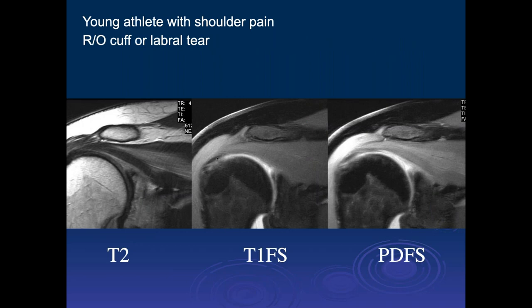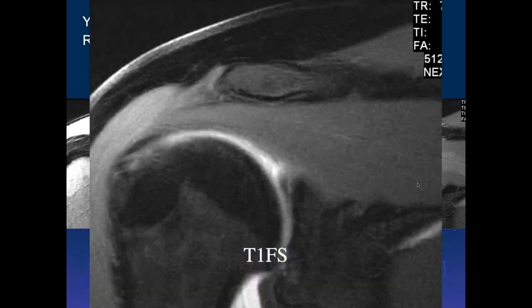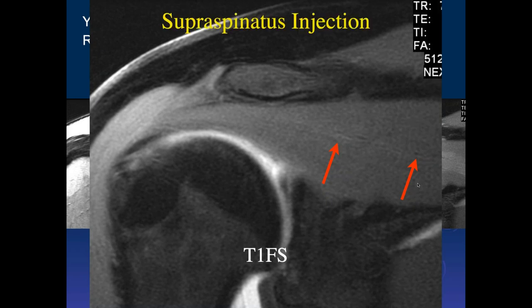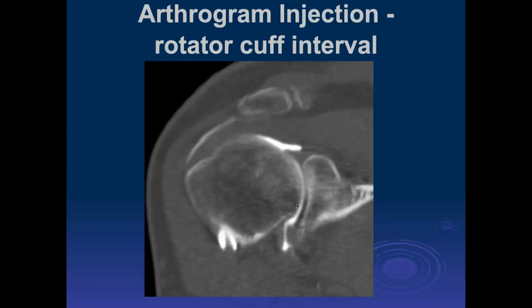Here's a young athlete with shoulder pain. On the T2 there's increased signal throughout the supraspinatus muscle. On the T1 fat sat arthrogram there's bright signal in the joint; there's also possibly some increased signal within the supraspinatus that could just be contrast. This is actually a supraspinatus injection.